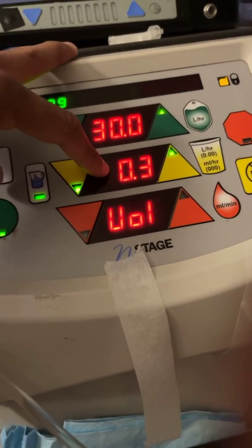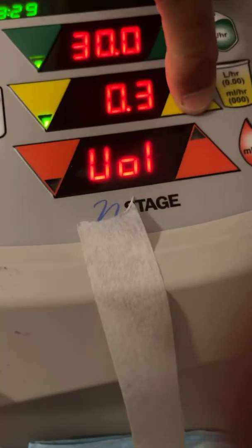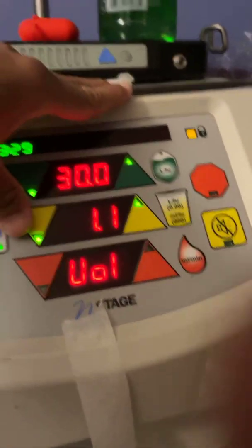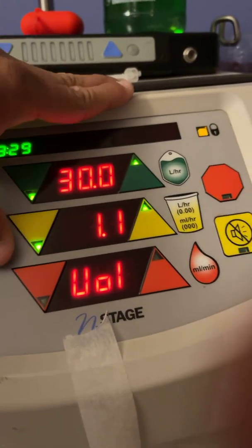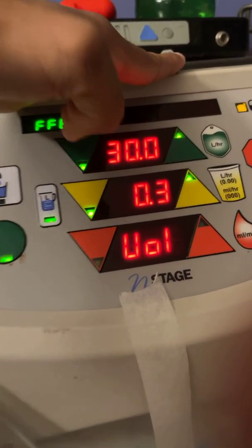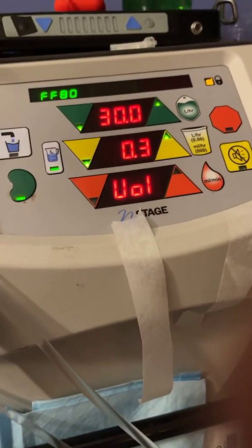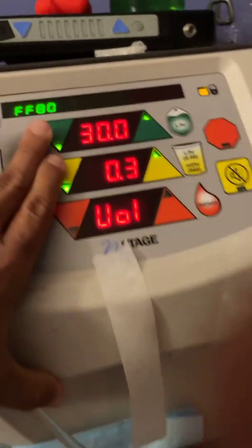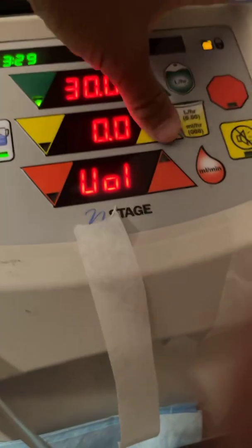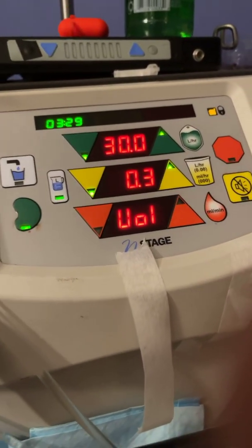And instead of removing, let's say I have 1 kilo or 2 kilos on, instead of removing 1 whole kilo, because it would look like this if I had 1 whole kilo. It would look like that, 1 kilo. Let's say I had 1.1 kilo on, right? Instead of removing the whole 1.1 kilo, I reduce this to only 0.3. And when the 0.3 is done, the machine will alarm, notifying you that you pulled off all the fluid. But mind you, I have 1.1 kilo. So what do I do when this goes to 0? And then my alarm, when it tells me that I pulled all the fluid off, boom, beep, beep, beep. I raise it back up during treatment to another 0.3. So I keep doing that.